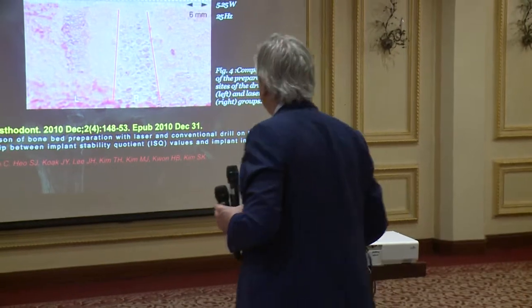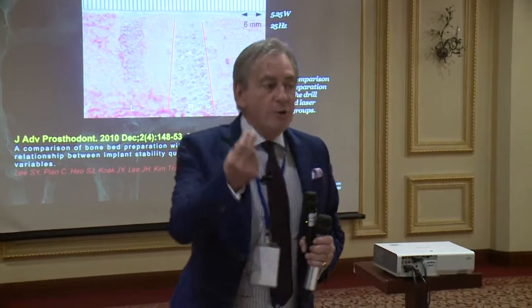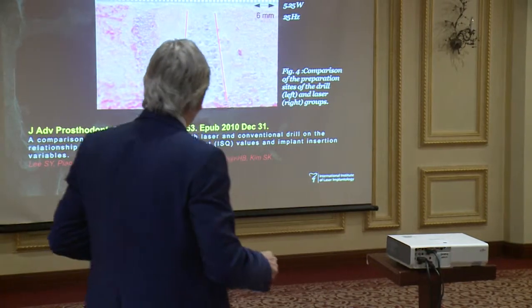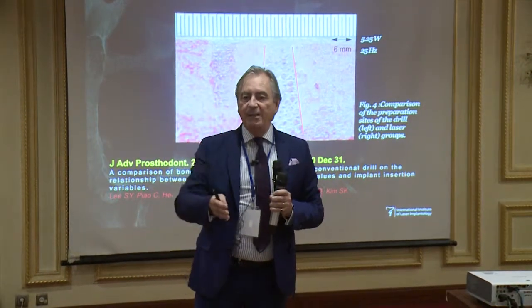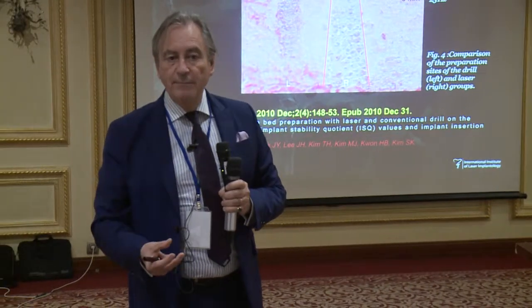This means that exactly the same thing happens, because of its own structure in the bone, in the cancellous bone. That means that if you're using devices like rotary instruments or piezo surgery, you will leave bone debris all the time.